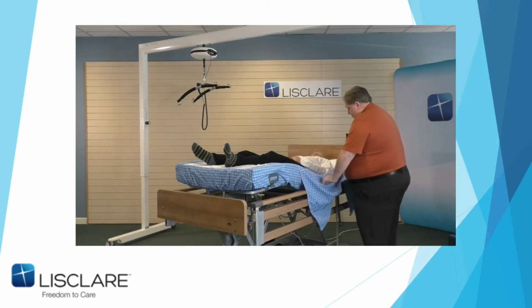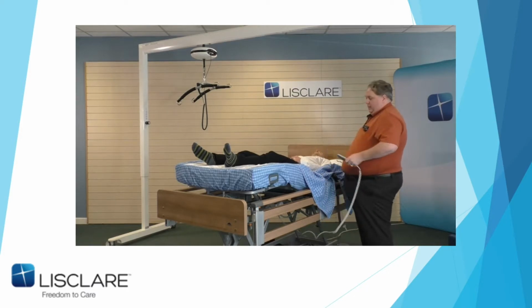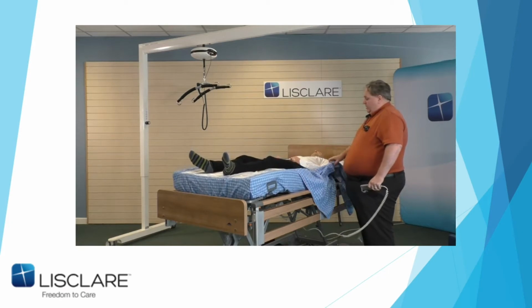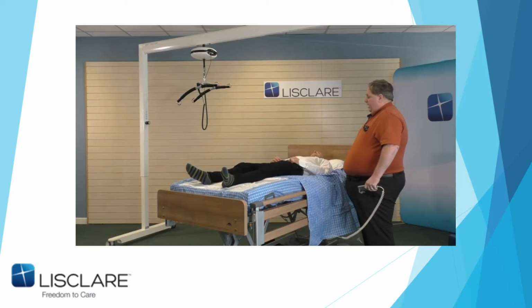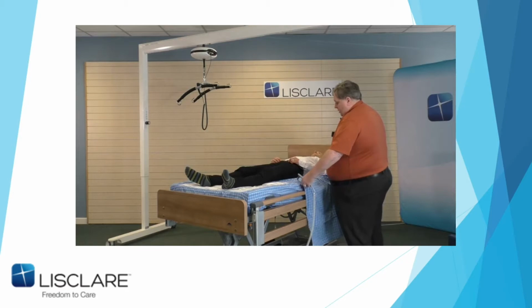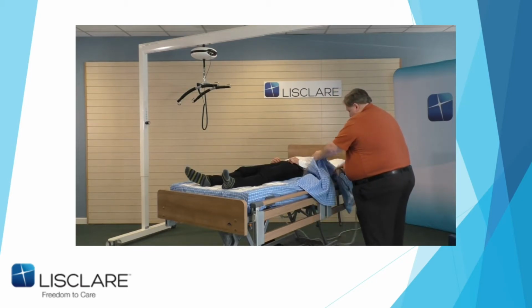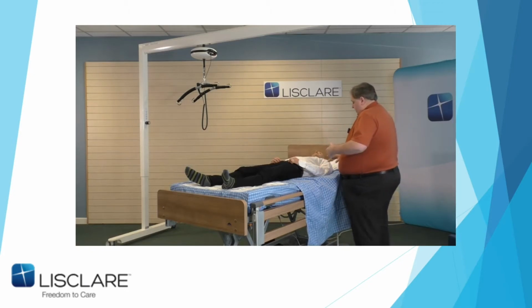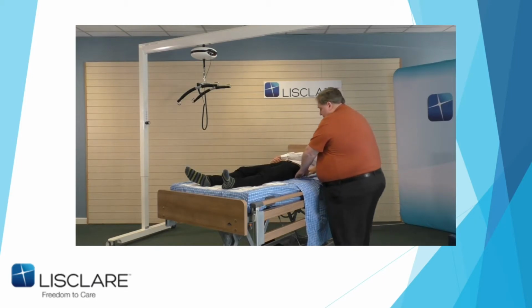Now, this is one thing I want to put the bed down flat so you can see this. There's a technique here that takes a bit of practice, and you'll see this more when I'm turning on the bed. But because I've pulled John back diagonally, what I want to do now is get him square on the bed, so he's up the middle. So hang that back up again. And what I tend to do, if I only can work from this side, is I'll bring John's hand across, and I'll maybe just do the hips first.